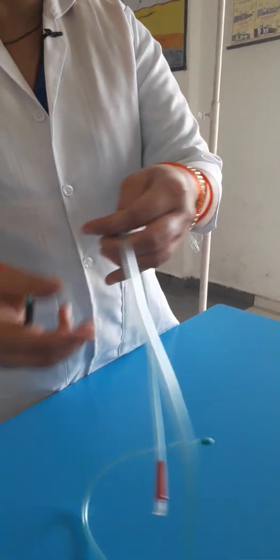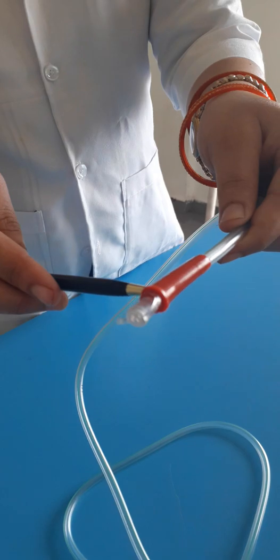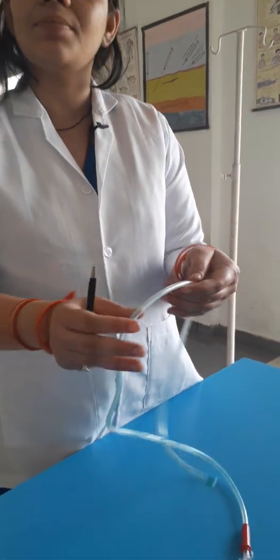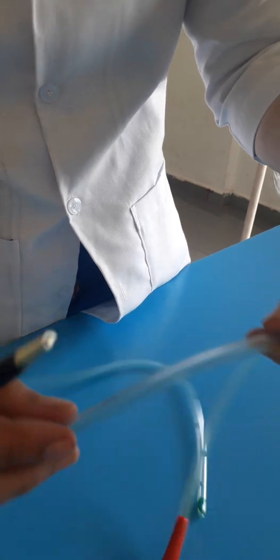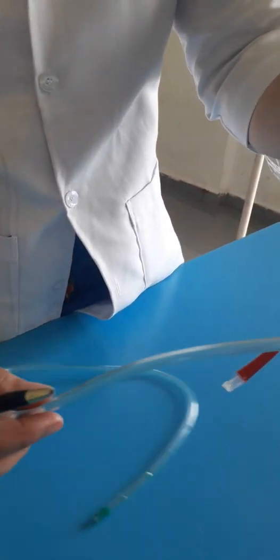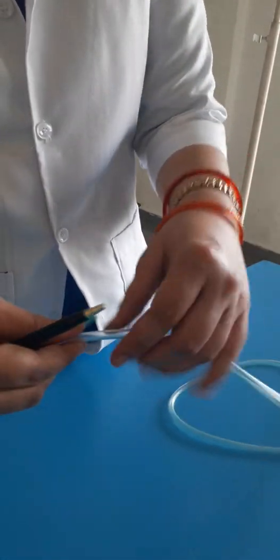This whole part is known as the body part, and this part is known as the base part. In the body, what you have to remember is that there are markings. There are basically three markings — the first marking, the second marking, and the third marking.